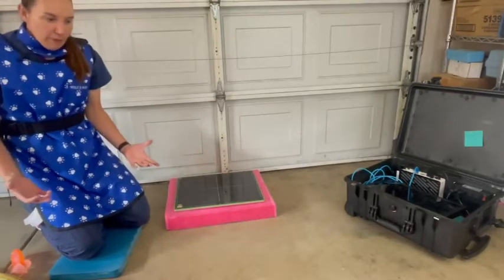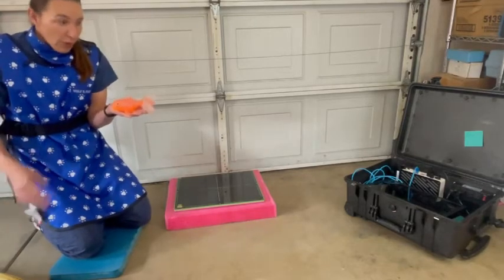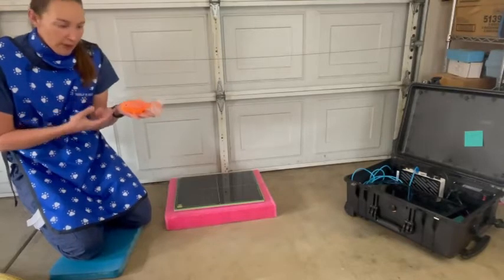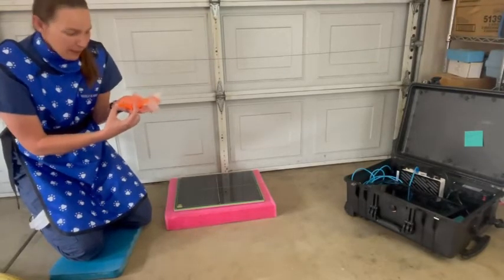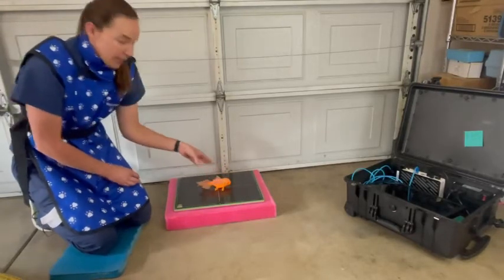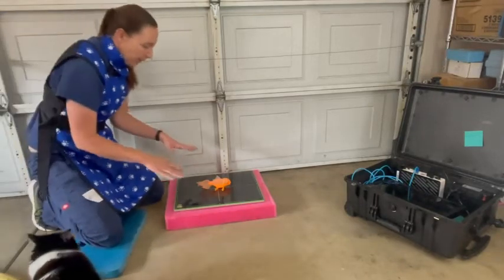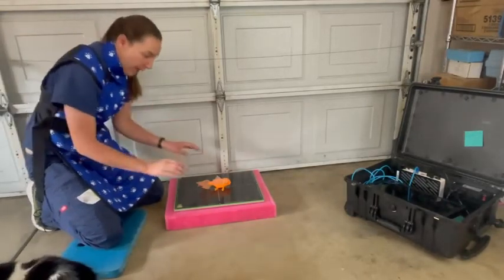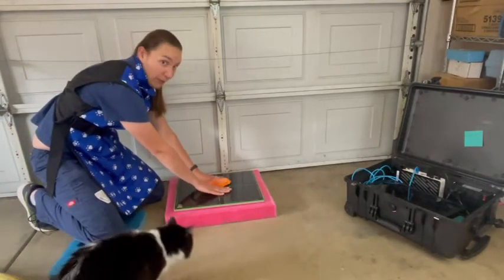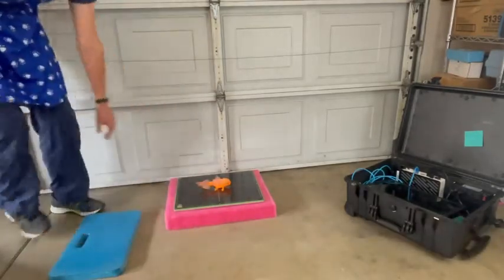So what are you going to do if your fish is not a koi? What if your fish is a little tiny goldfish? This is actually a very large goldfish for these purposes — I've done one last week that was only about this big. But the same properties apply: they're going to do the dorsal-ventral. For these guys, especially fancy goldfish with those big round tummies, in order to get them restrained properly I'll actually inflate two tiny zip-lock bags full of air and tape them down to the panel, and that will keep the little goldfish upright. Same as with the big fish, once he's all positioned, we take the shot.